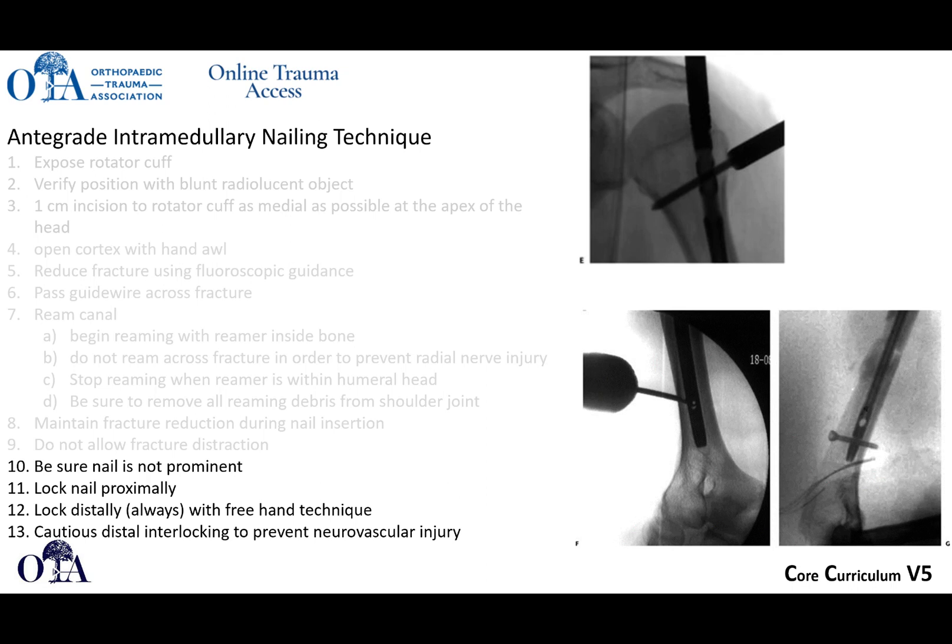Usually you want to go down, get retractors in there so you can clearly see where you are and avoid neurovascular injury.